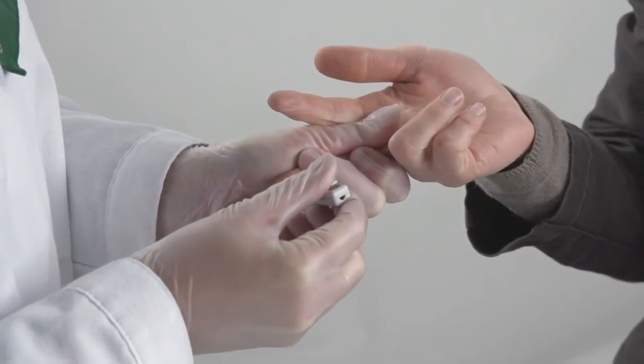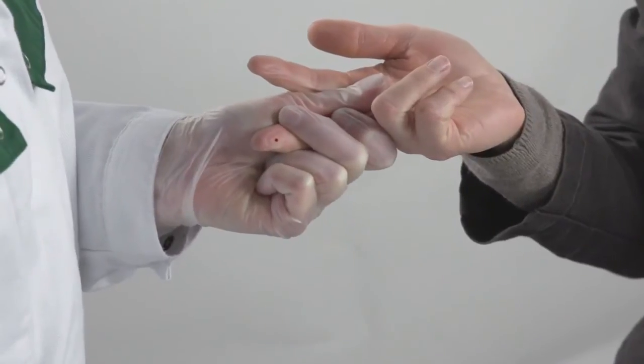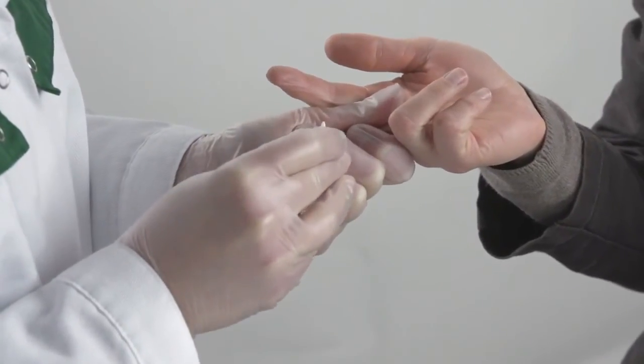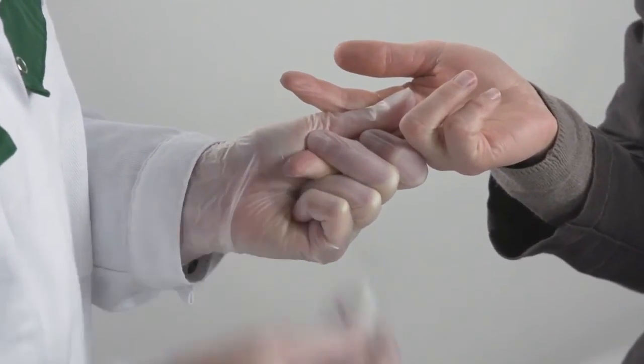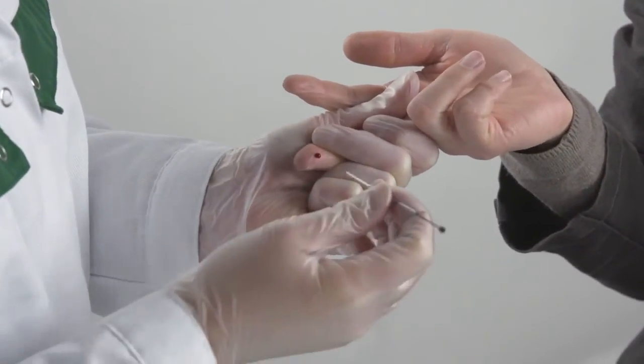Prick a clean finger with a lancet. The prick site should be in the side of the finger, preferably in the middle or ring finger. Wipe the first drop off, put the capillary into the next drop and let it fill up to the white stopper.